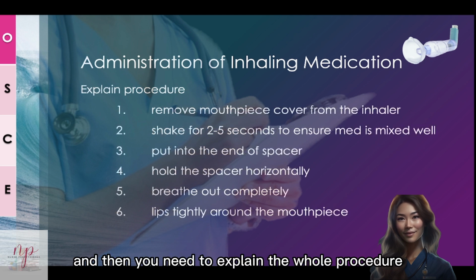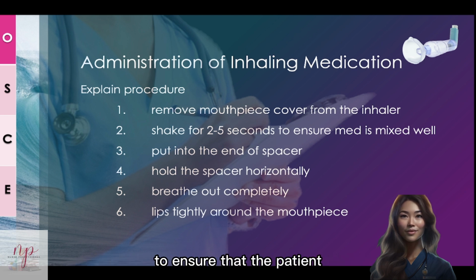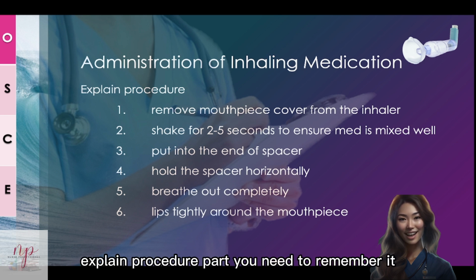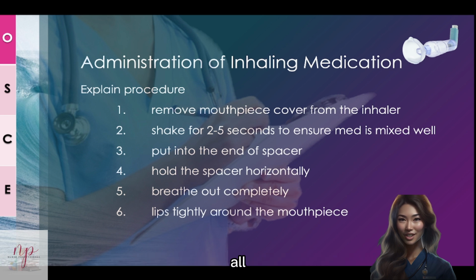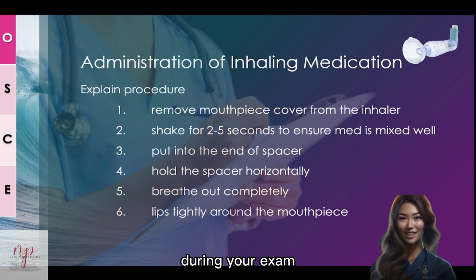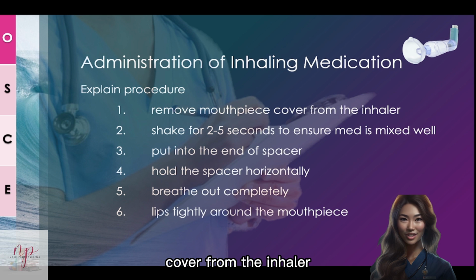And then you need to explain the whole procedure. This is very important because you need to explain the procedure to the patient to ensure that the patients understand how to perform the inhaling medication. So first, for this explain procedure part, you need to remember it all. You need to remember, and then, just like a script, you need to read it out during your exam. First, you need to remove the mouthpiece cover from the inhaler.